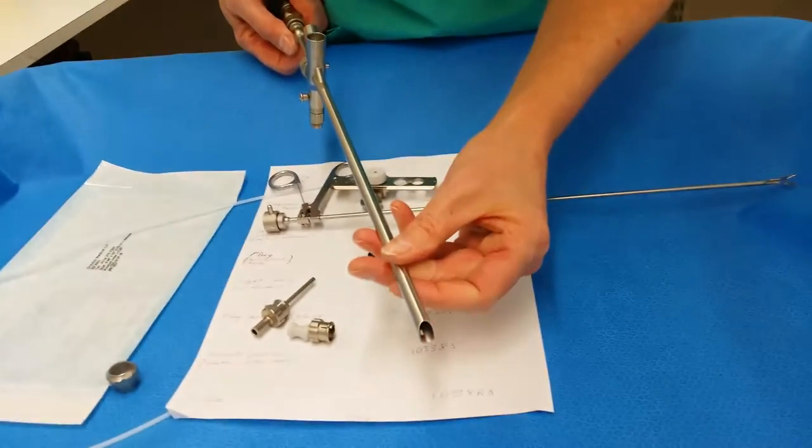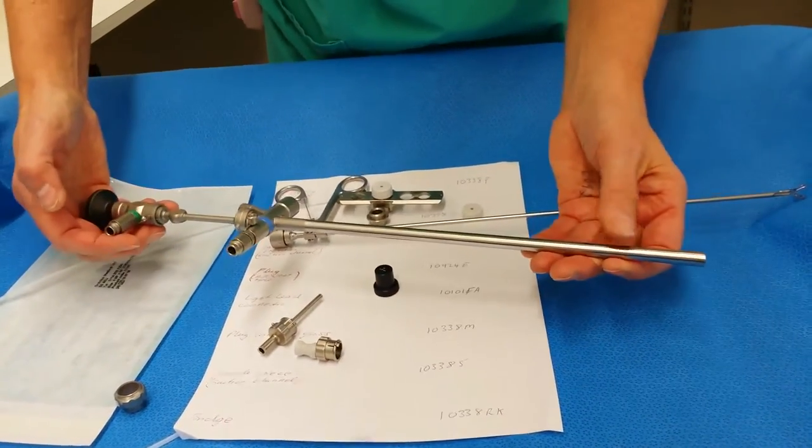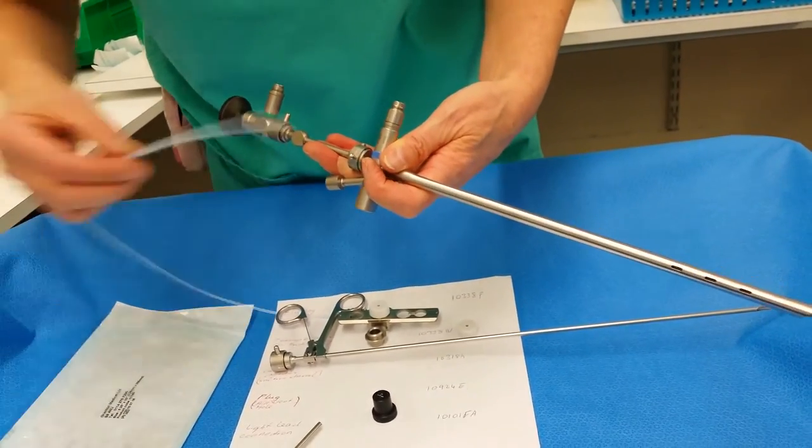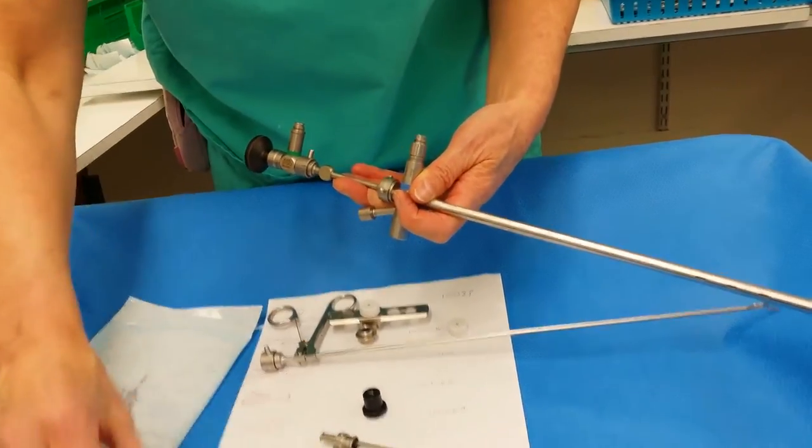So the surgeon can get a good view initially. You can see the scope is just at the end there, and the light lead would be attached there.